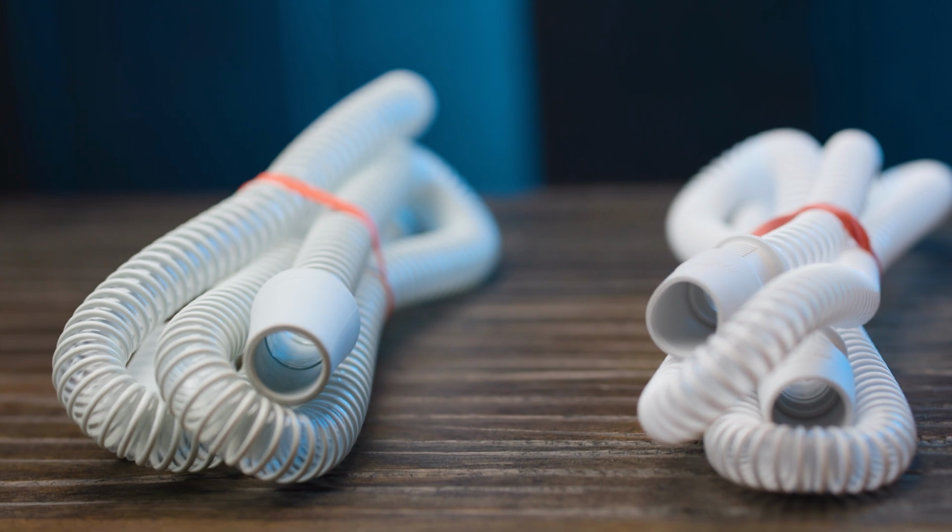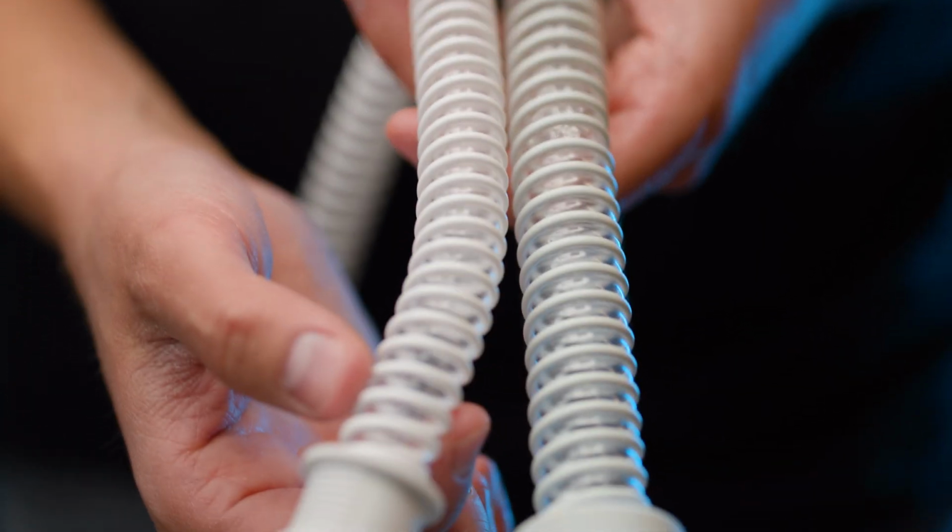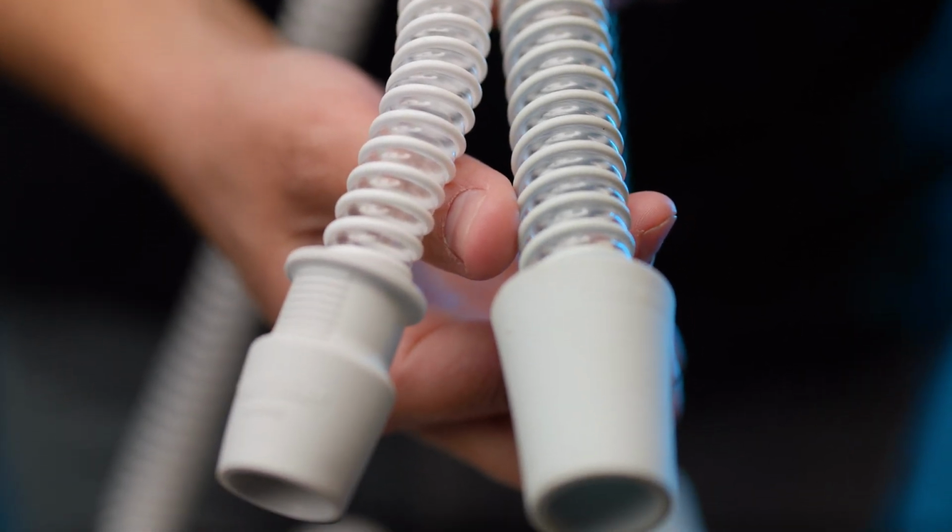Okay, so let's say you are going for non-heated tubing. The next decision you need to make concerns the length and the diameter. With diameter, the standard tubes have an inner width of 19 millimeters, but slimmer tubes, also known as SlimLine tubes, have an inner width of 15 millimeters. And there are even a few tubes that come in micro size of only 12 millimeters.